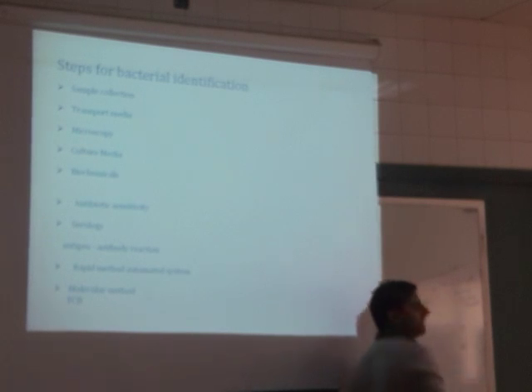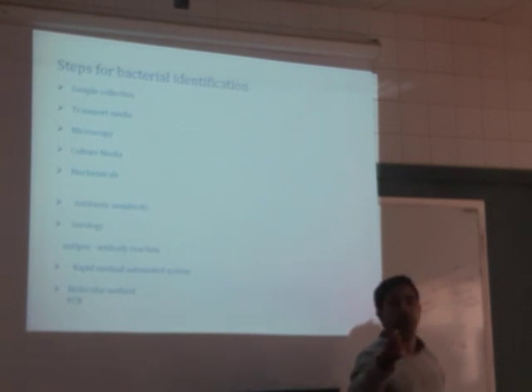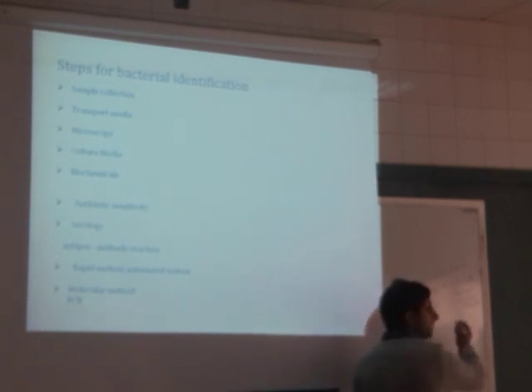You have heard the name of an amino acid. What is tryptophan? Tryptophan is an amino acid. Some bacteria break down tryptophan with the help of the enzyme tryptophanase. So the tryptophanase enzyme is present in bacteria.